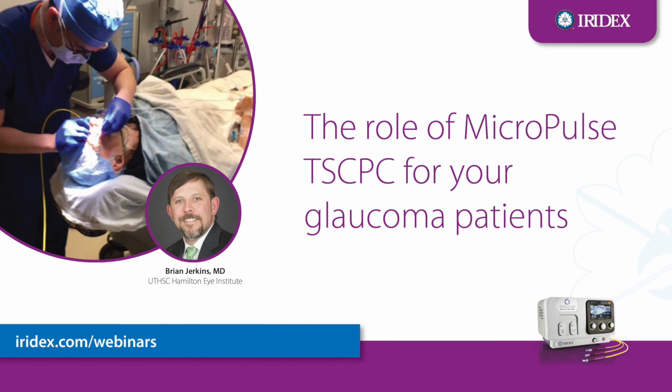Well, here's another somewhat related question. Is it okay to pass the probe in standard fashion over thin or ischemic conjunctiva, especially from a previous filtering or tube shunt procedure, or should this area be avoided? I think if it's vascular and you're very careful with the probe, it can be done.